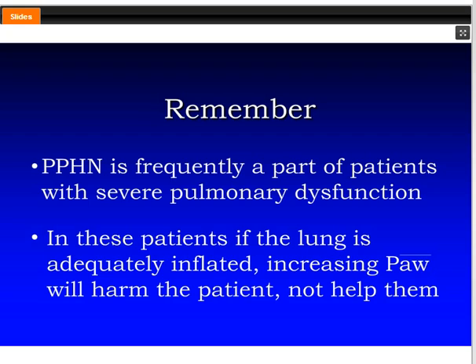The reason is that, as I'm sure they know, a portion of their babies are going to be infected, and if you're using 12 to 15 hertz, you are likely to air trap them even before they get into a more chronic stage.